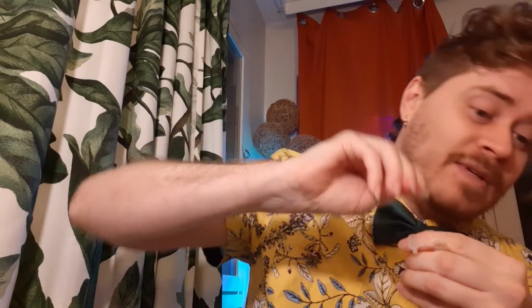Quiet, you. Cats always help a procedure like this, so make sure to involve your cat. Every time you're sticking anything in your nose or working with a contact lens, they know, so they'll be there to help you. So we're going to take this buffer solution, stick it in here. Oh. Why is your voice so rusty?